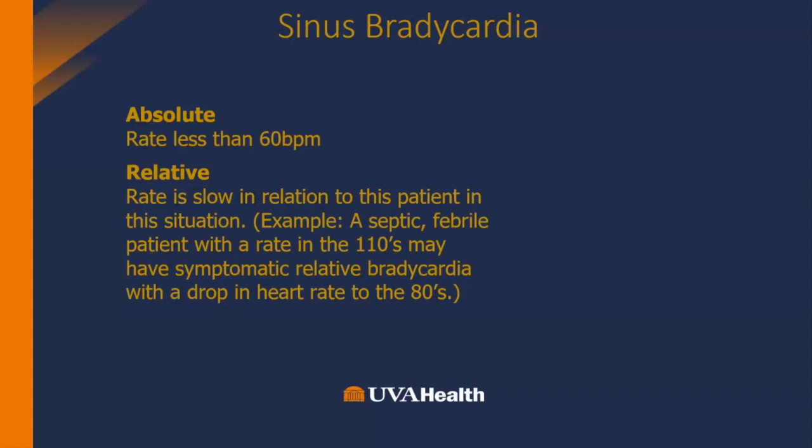Well, in the clinical context, that paints a picture of a relative bradycardia because in the presence of those symptoms, we'd expect the heart to be compensating and beating faster. And in the absence of that response, the heart is relatively bradycardic. So it is not an absolute number. It is relative to the physiologic condition of the patient that we should use as a determinant.